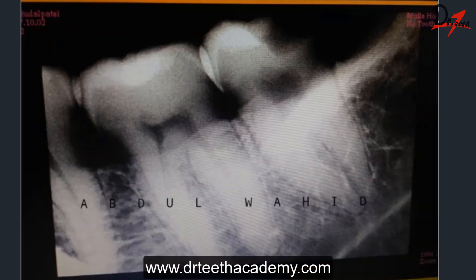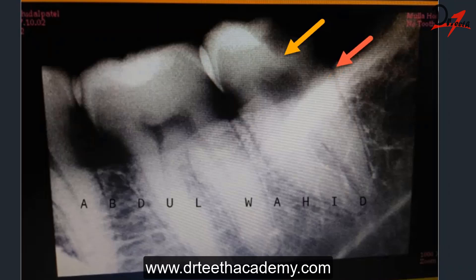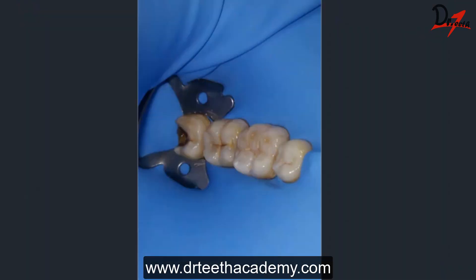Coming to the radiograph — this is the IOPA of the same case. We can see the pulp chamber is still safe; the caries activity has not yet reached the pulp chamber, which is a good thing. We also need to look at the height of the alveolar crest bone to judge how deep the caries lesion is. This is a difficult but manageable case.